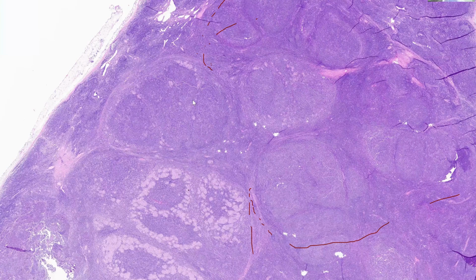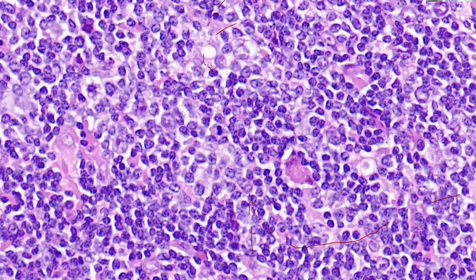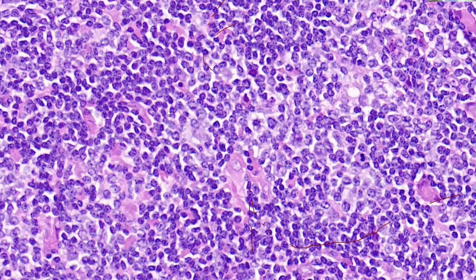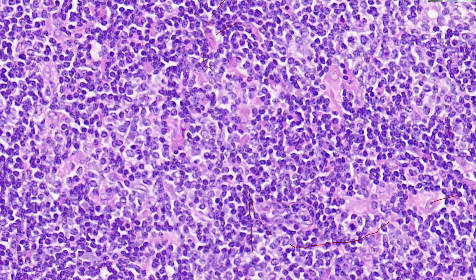And if we zoom in on one of these nodules, you will see that you have large cells with a rosette formation of smaller lymphocytes in the background. This is a typical picture of nodular lymphocyte predominant Hodgkin lymphoma.